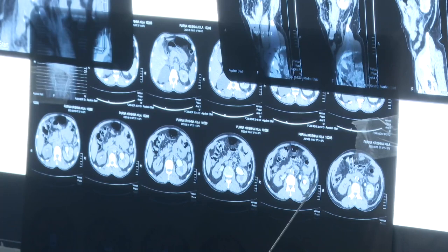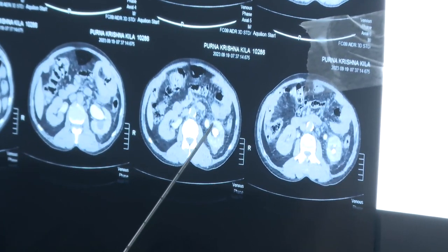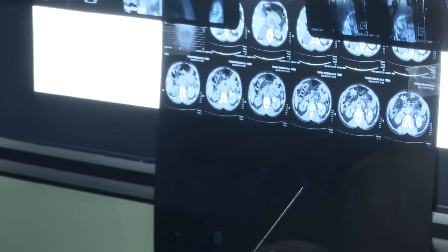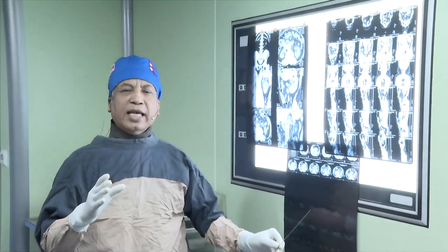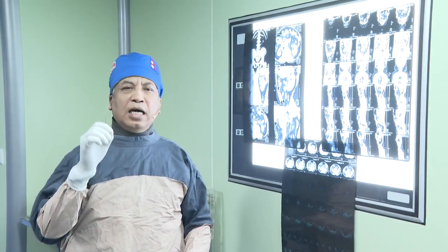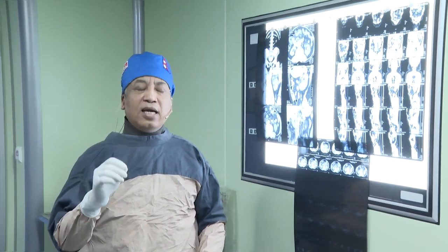So I will try to avoid lower calyceal puncture and go either mid calyx or upper pole. In my regular practice, I go to the middle calyx in 70% of cases, 20% to the lower calyx, and 10% to the upper pole. However, it all depends on the stone location in the kidney to choose the appropriate calyx.